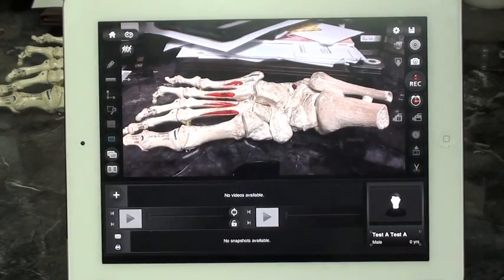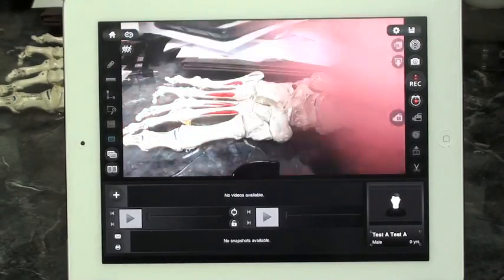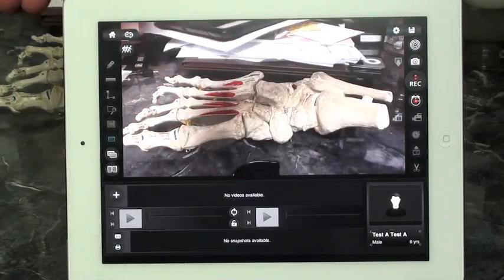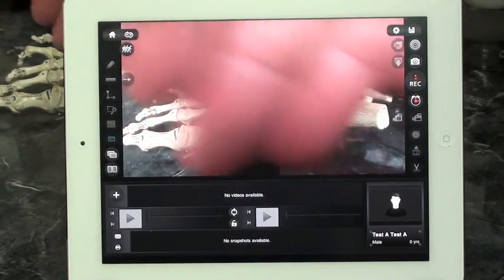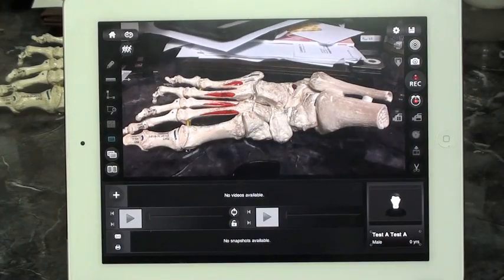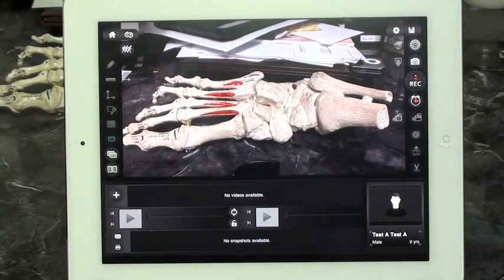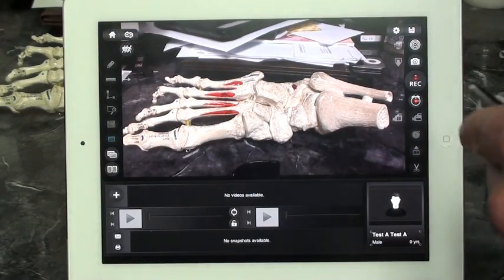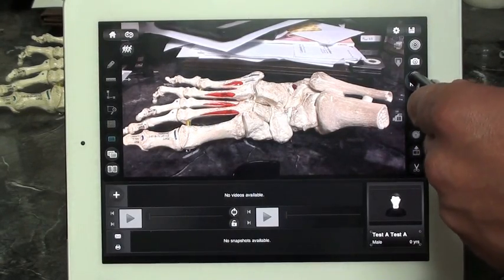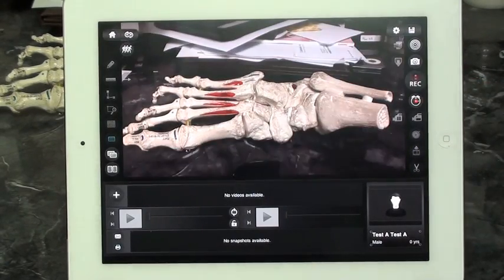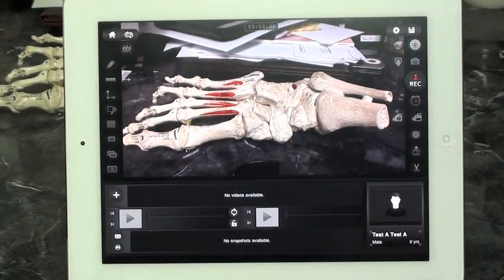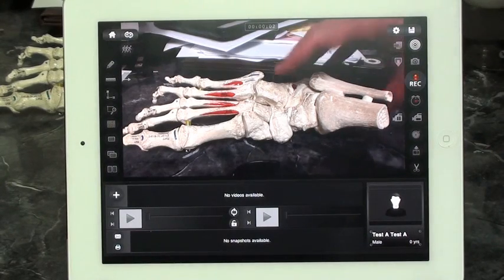After you set up your database, simply click on the folder and you'll get an active viewing screen. Hit the record button and it will immediately start recording. Hit the record button again to stop recording.